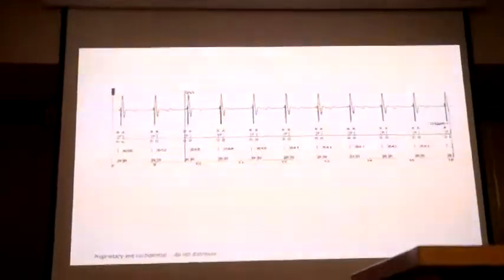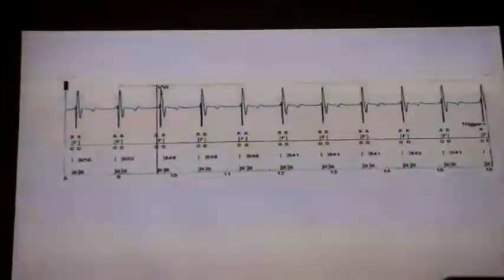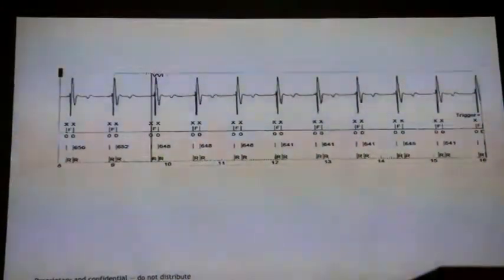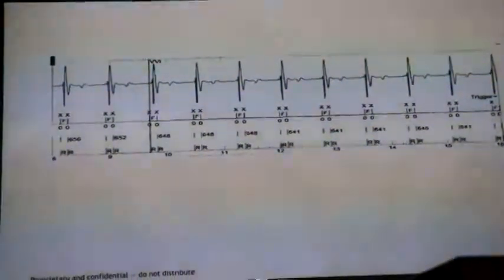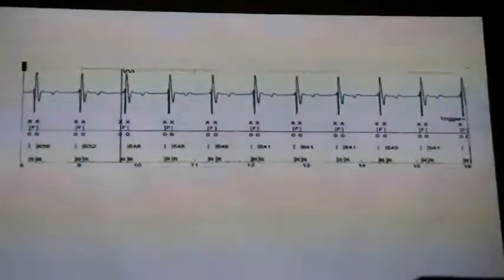Okay. So here we have a ventricular, this is a defibrillator lead sensing. So this is double R-wave sensing. We've got a marker here, and the signal is seeing it twice. Okay.